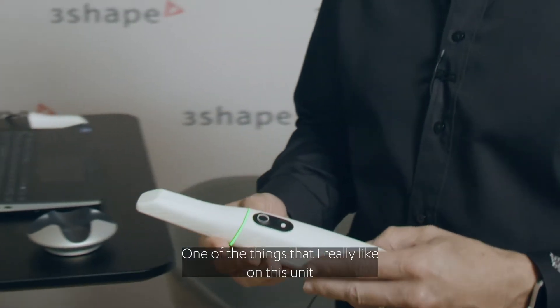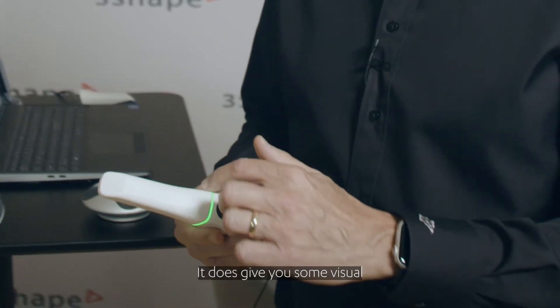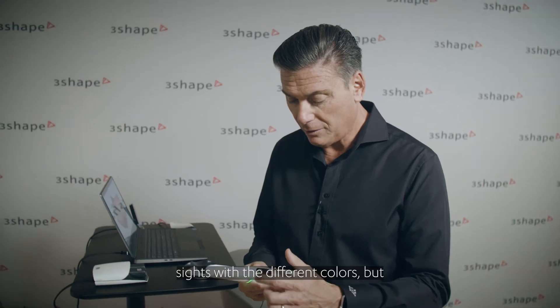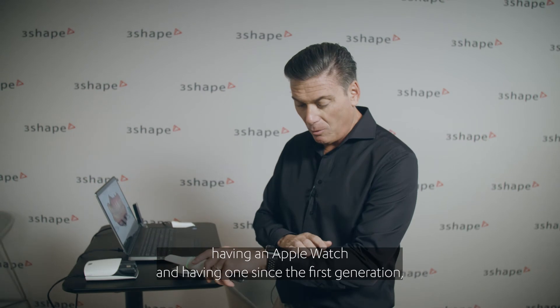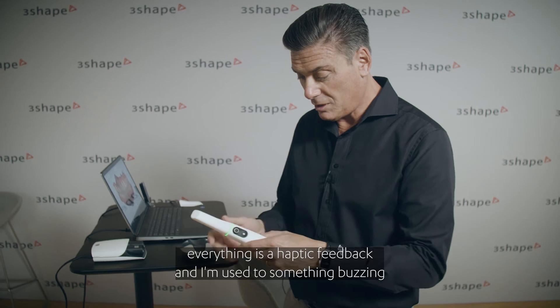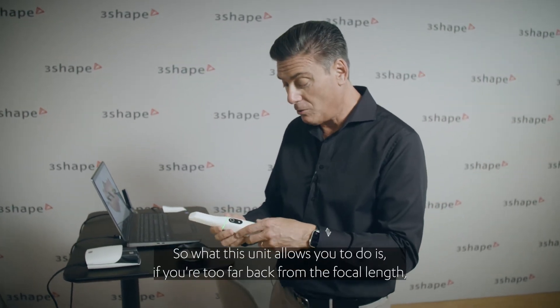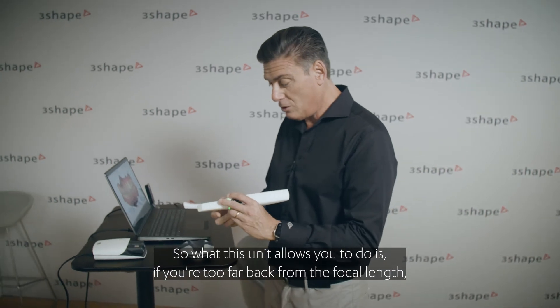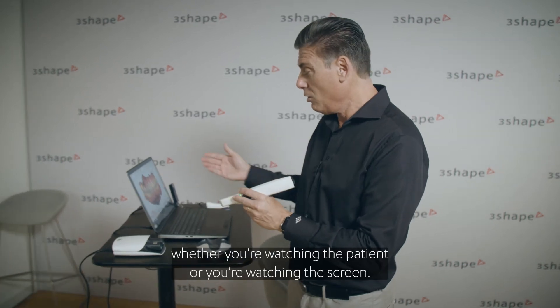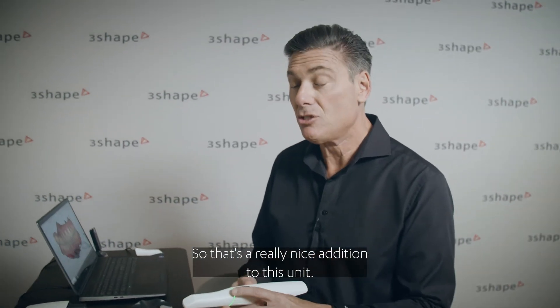One thing I really like on this unit is the haptic feedback. It does give you visual cues with different colors, but having used an Apple Watch since the first generation, I'm used to something buzzing in my hand when I'm doing something incorrect. So if you're too far back from the focal length it'll buzz and let you know, whether you're watching the patient or watching the screen — that's a really nice addition.